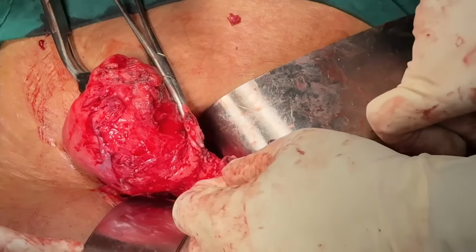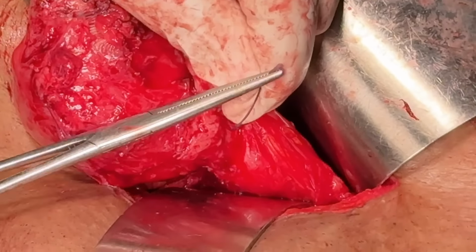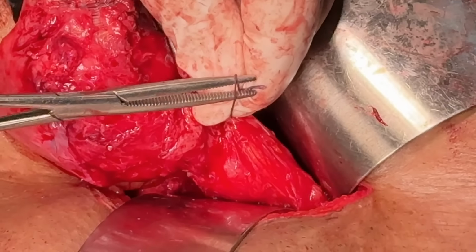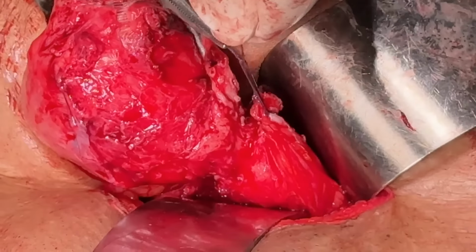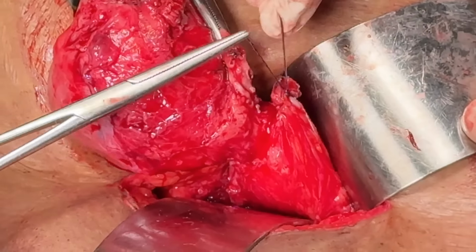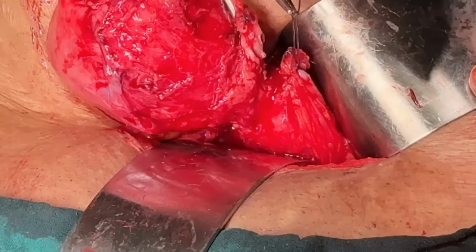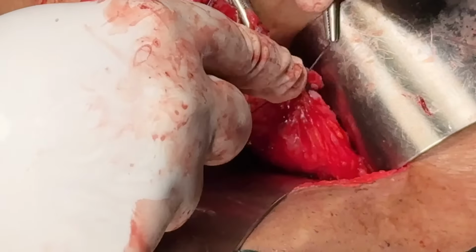So wrap one end, the longer end, on one of the index fingers. Make a loop out of that and take the smaller end through that loop. Cross your hands to make a cross knot or a square knot, and then second knot with single throw, and also the third knot with a single throw.